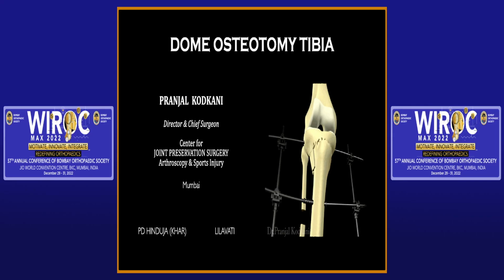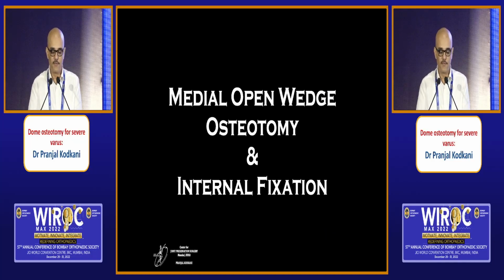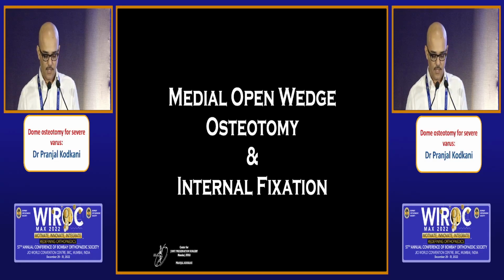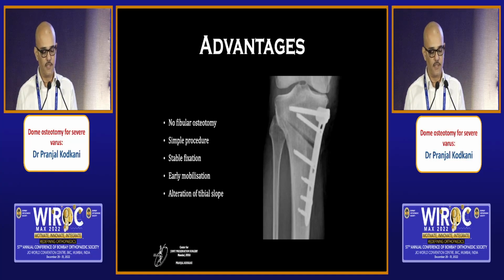Good afternoon. Now, coming to dome osteotomy of tibia for treating tibia vara. Well, medial opening wedge osteotomy with an internal fixation device, as we've seen earlier, is the most commonly used option, and it's quite popular because it has a number of advantages. No fibular osteotomy is required. It's quite a simple and straightforward procedure, allows for stable fixation, early mobilization, and if you need to alter the tibial slope for managing ligament deficiencies, that is possible using this procedure.